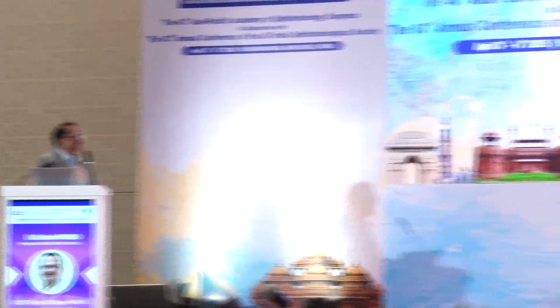Wonderful lecture, sir. I would like to ask, many times when we get the lenses for some toric lenses, for example like 21.5 diopters, it shows residual refractive error would be plus 0.25. If we get 20.5, we get minus 0.25 or 0.75 of the refractive error, because we don't get it in odd numbers. So what would be your choice for toric lenses in residual refractive error of plus diopters or in myopic diopters?